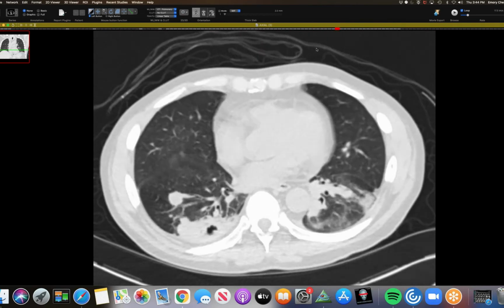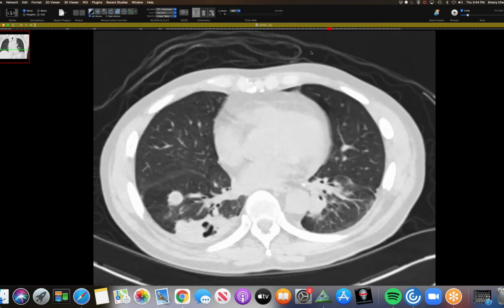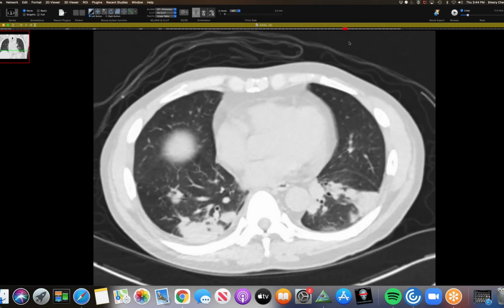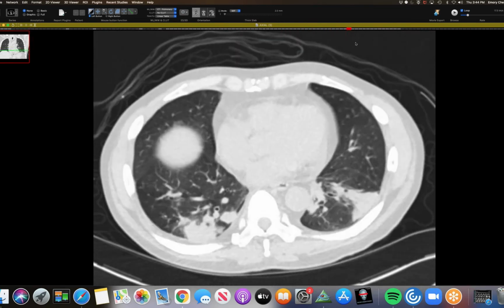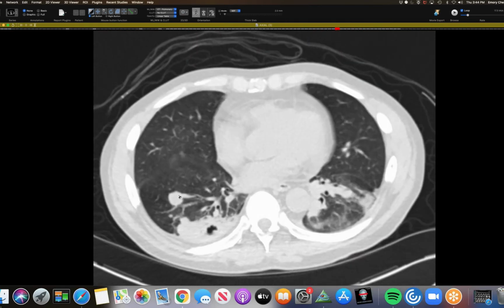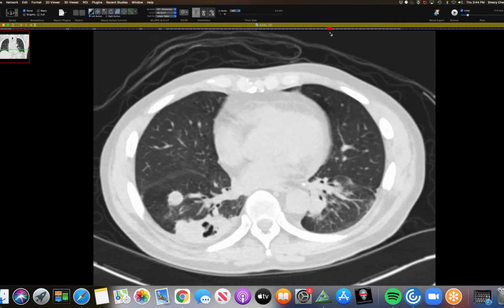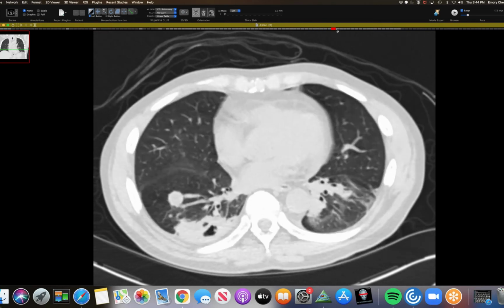I was talking with one of my colleagues about this, because I remember reading in one of the lung imaging infection books by Dr. Mueller that in the section on Cryptococcus, immunocompromised patients tend to have more patchy, ground glass, ill-defined opacities than immunocompetent patients, who are more nodular.